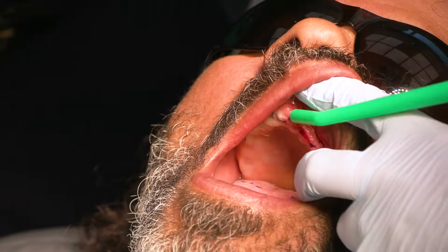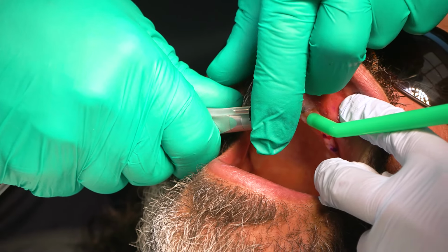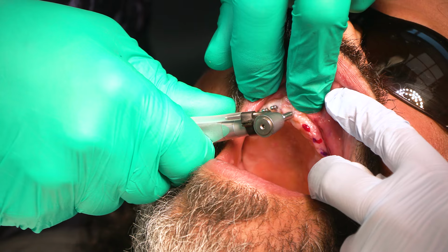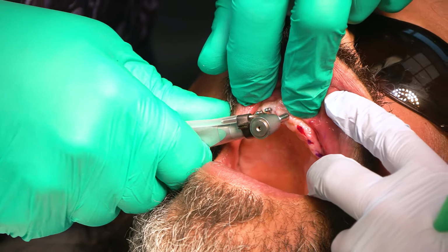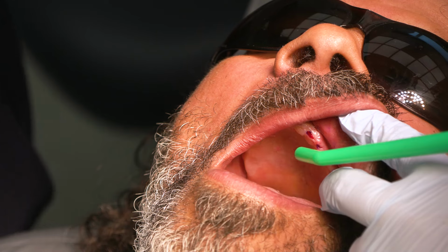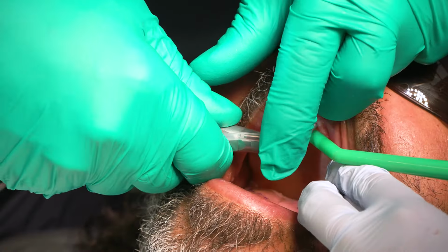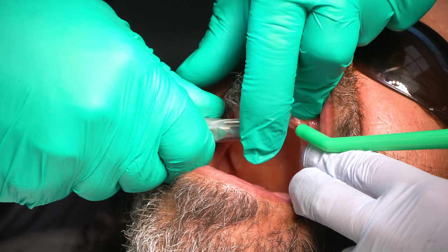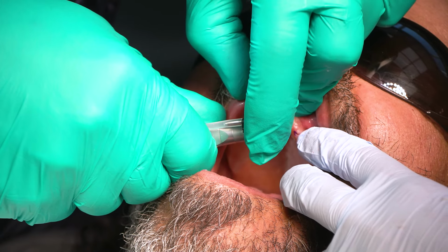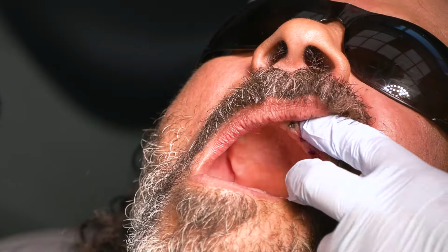You doing okay, Robert? All right, thumbs up. Okay, almost reached 60 newton centimeters on that one. Bone is doing good. Those are good sounds, Robert. That means the bone's nice and solid.